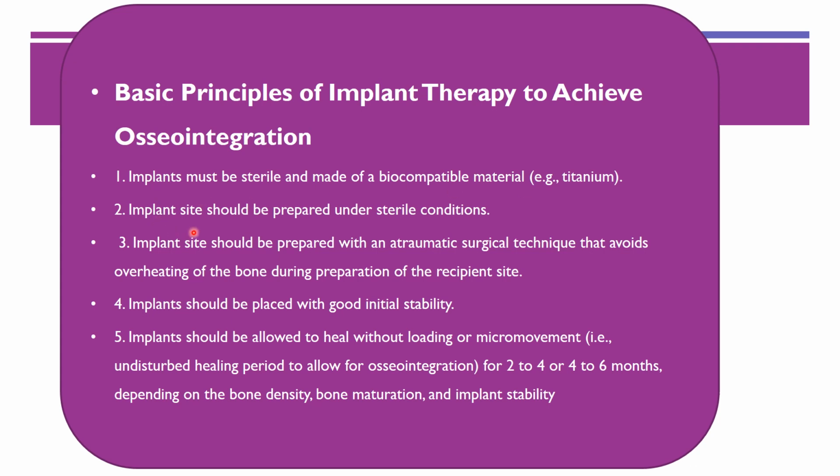The implant site should be prepared under sterile conditions, with an atraumatic surgical technique that avoids overheating of the bone during preparation of the recipient site. There is a pumping action: when you drill the area, you have to move up and down, and it should also be irrigated with cool saline.